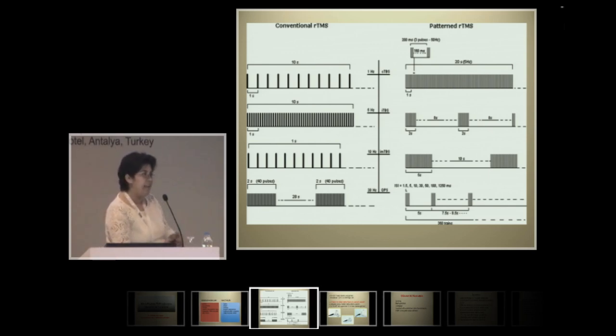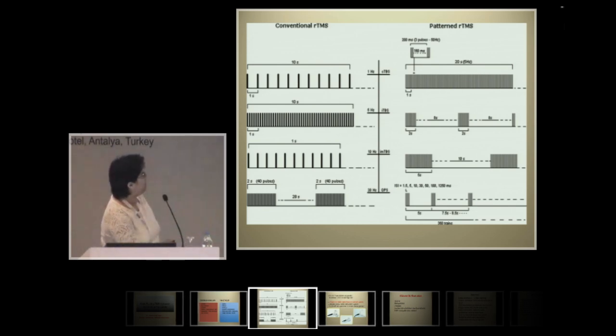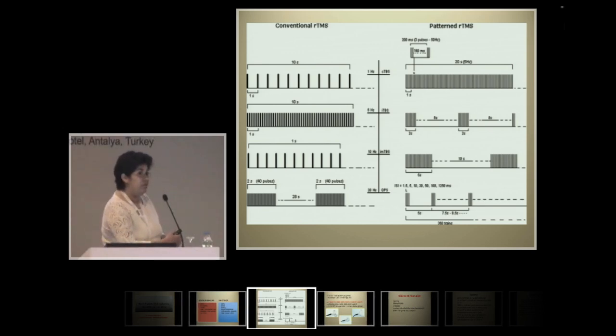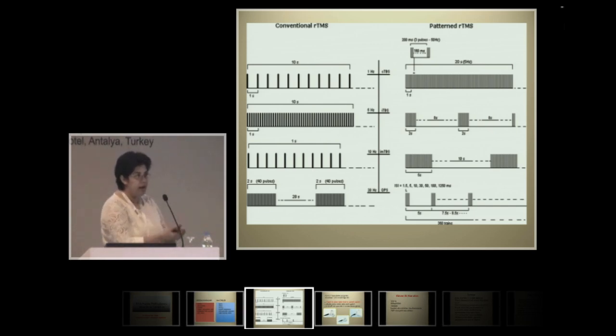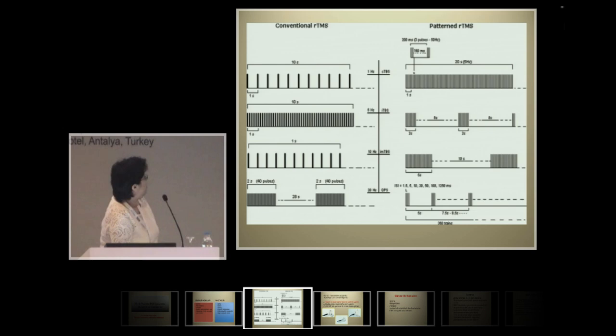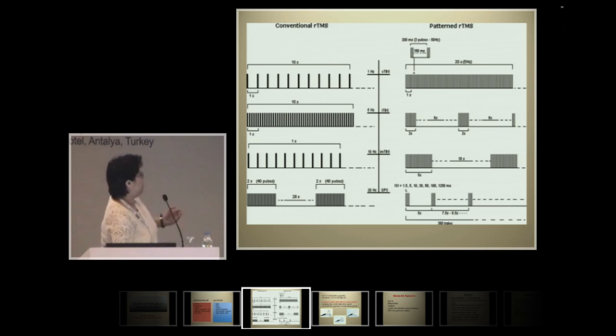What we apply in the clinic, of course, are not those conventional treatments. Now, when you talk about a pulse, we refer to individual pulses. Our treatments have a specific shape. So you don't have a specific setting for the different psychiatric conditions on the device itself, so you have to adjust the settings yourself. So in 2 seconds, 40 pulses, which corresponds to 20 Hertz.